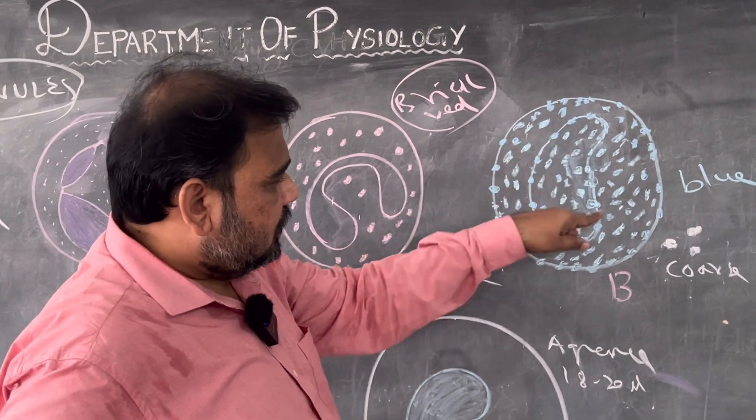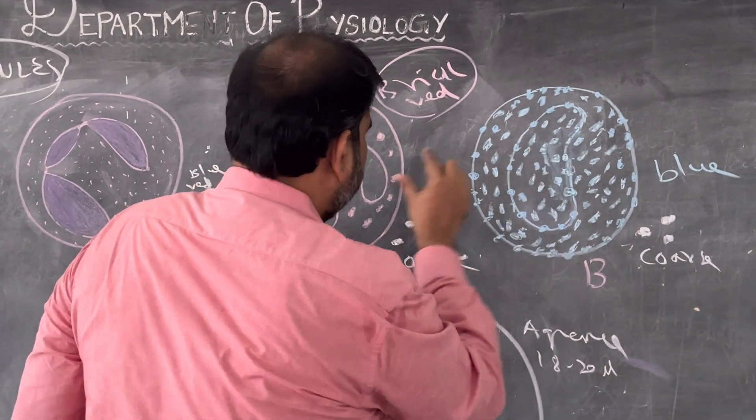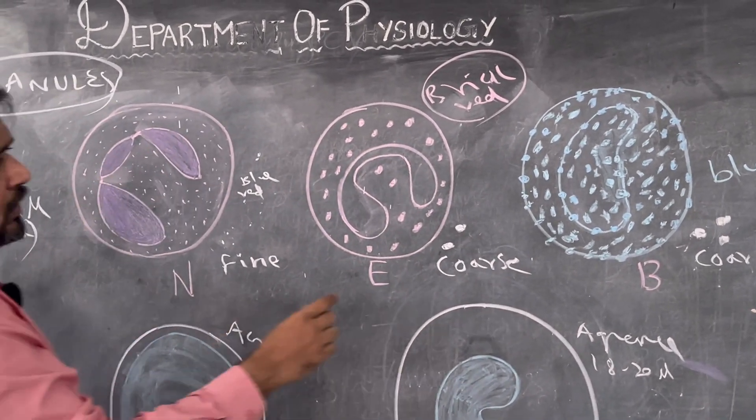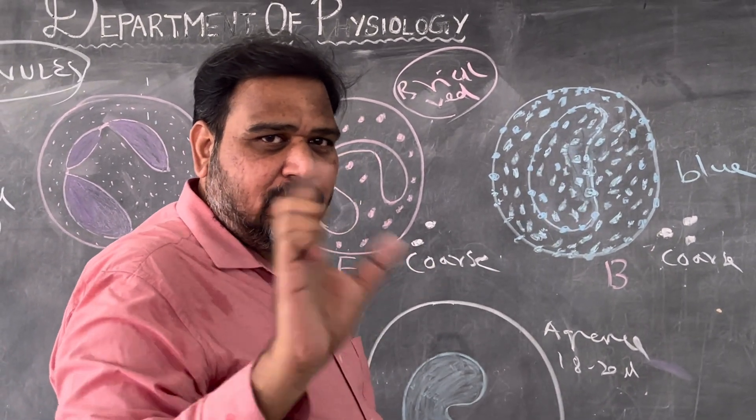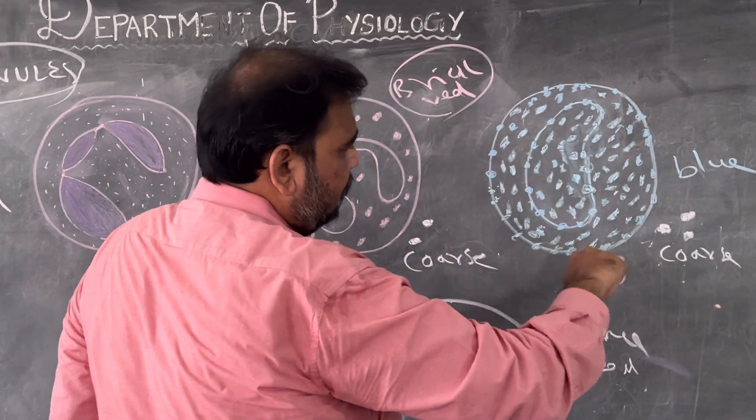And one more thing you can see here: the granules are so much that you see here. Whereas here the nucleus are able to see bilobed, here it is three lobed, here it can be single lobe or bilobed. But lobes you cannot differentiate much, but that is not the important point.